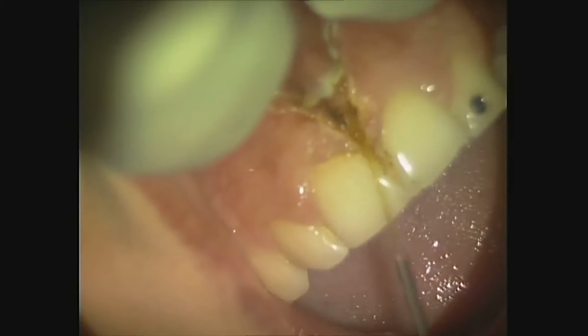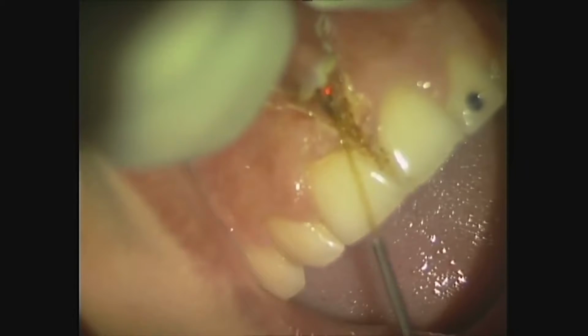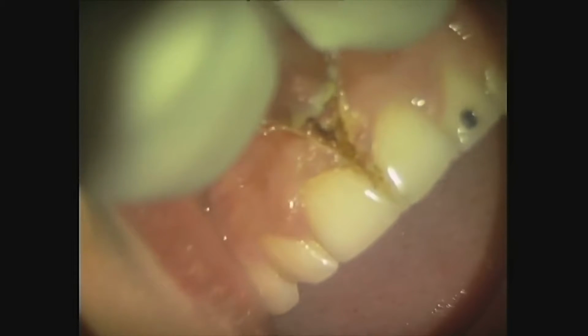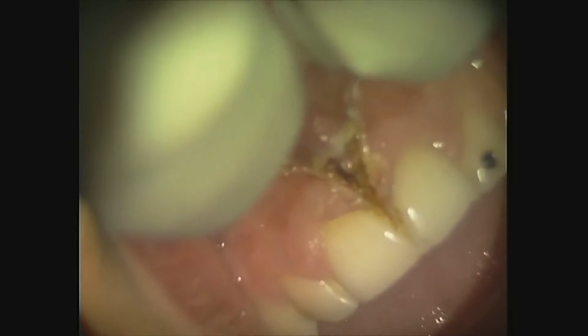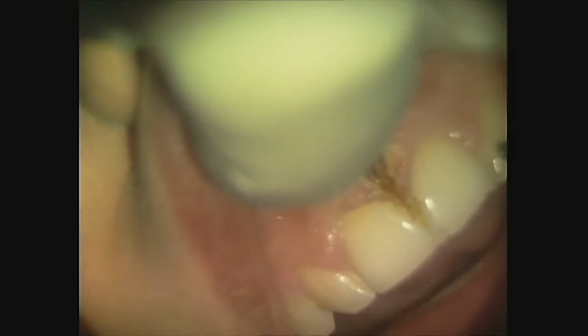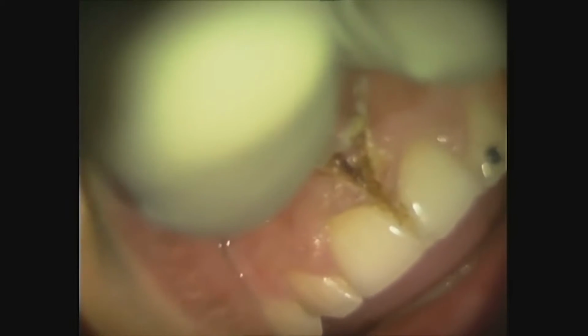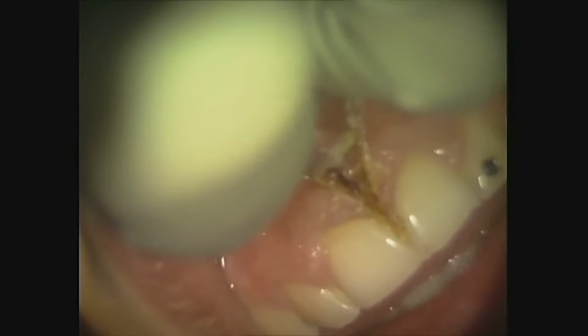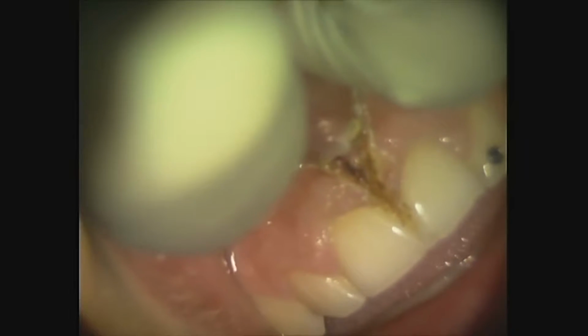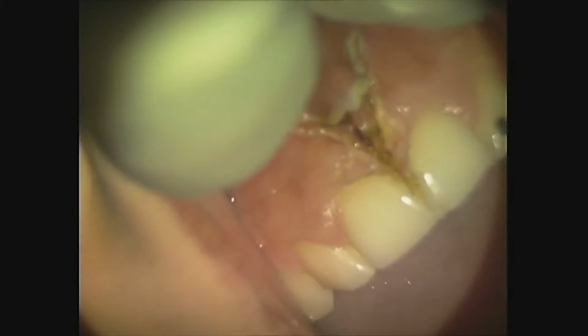Look, but now we change from one wavelength to the second wavelength, the 445, to control the bleeding at the back. So we go to the other procedure. We change to the second setting, 445. I set it only 1.8 watts in a continuous wave mode. And we are ready to go. Clean the fiber, please.